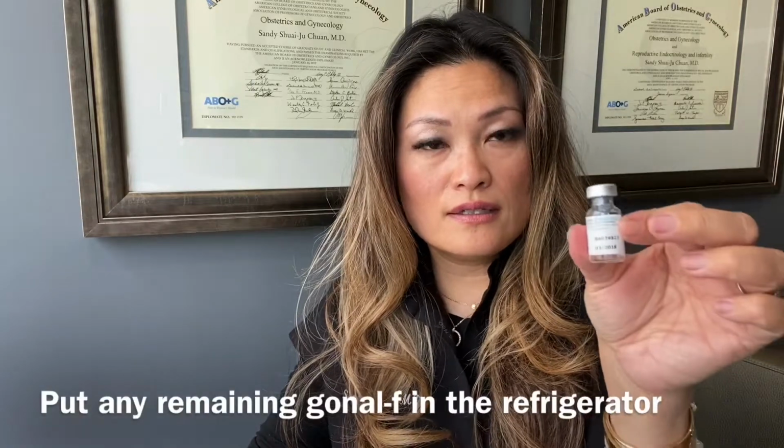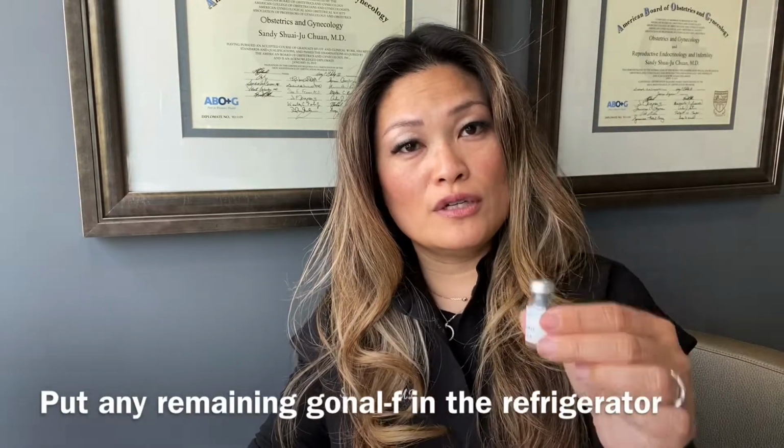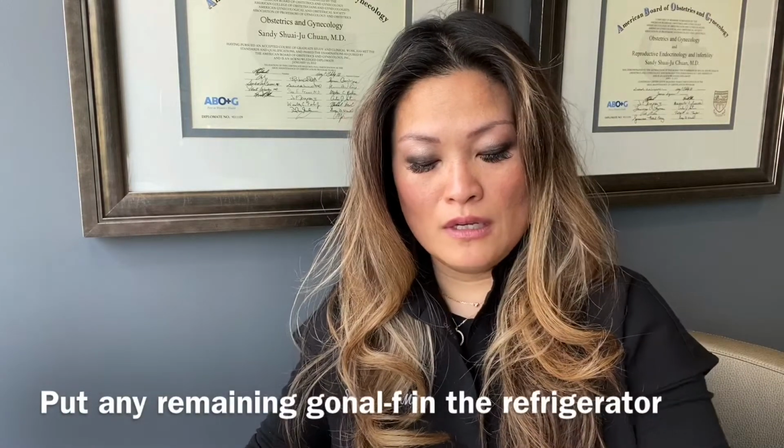And this remaining amount here, you want to go ahead and make sure you put it in the refrigerator, okay? So if you still have more to prep, then you can cap it and leave it. And I always think it's a good idea to get the cap on, even if it's not firmly on, to protect the needle so it doesn't get dirty while you're waiting. You might do your Menopur first. So anyways, here is your Gonal-F and it's ready, and you can set that next to your Menopur.